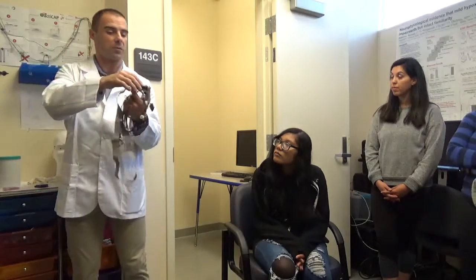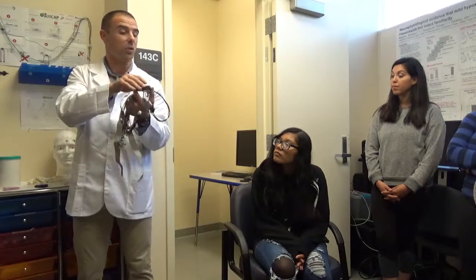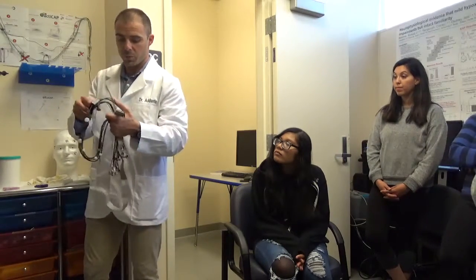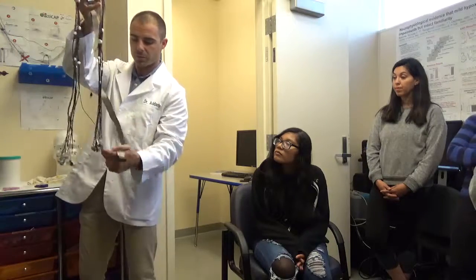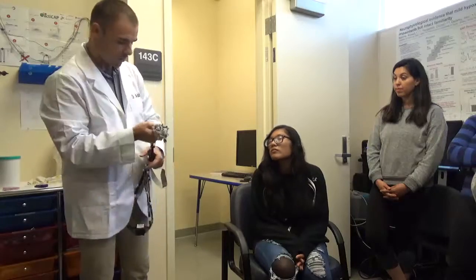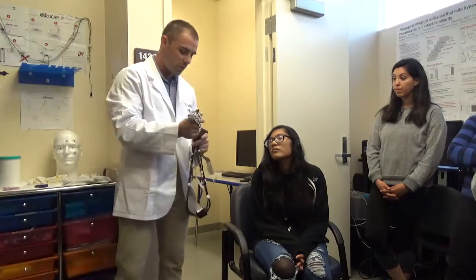Likewise, this splitter box, as it's called, because it splits the wires out, should also always be protected from water. And we'll explain that later, the procedures we use to make sure that happens, okay? But what we want to do is show them the electrodes, okay? So, we can kind of show Stormy here our electrodes, and we want her to be able to see, not just trust our word for it, right?